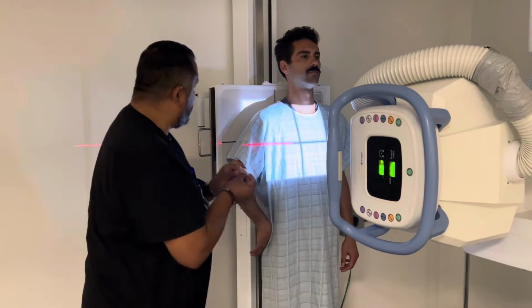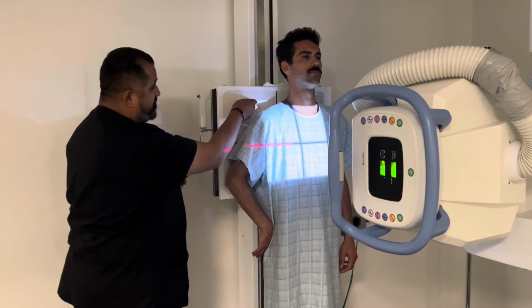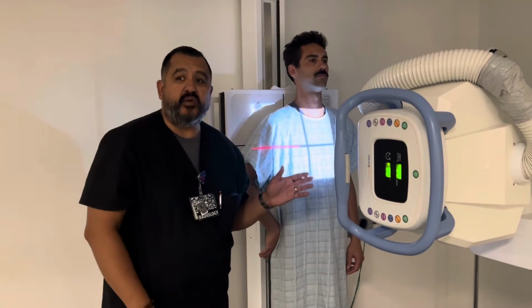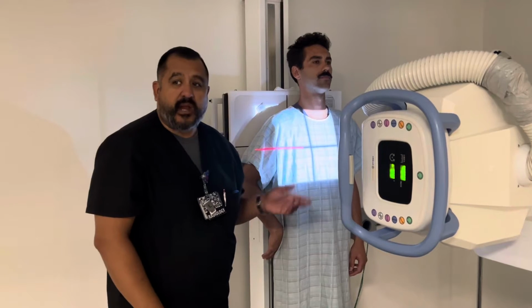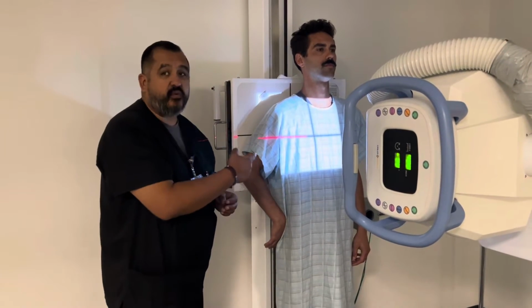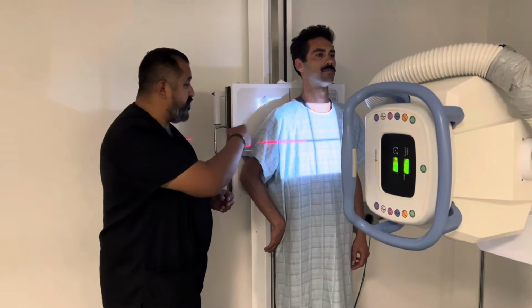I've got my right marker here. I'll put my right marker just on top of that shoulder right there. So this is going to be an AP, right unilateral, for the right posterior rib. Again, I'm doing an AP, right unilateral, for the right posterior rib.